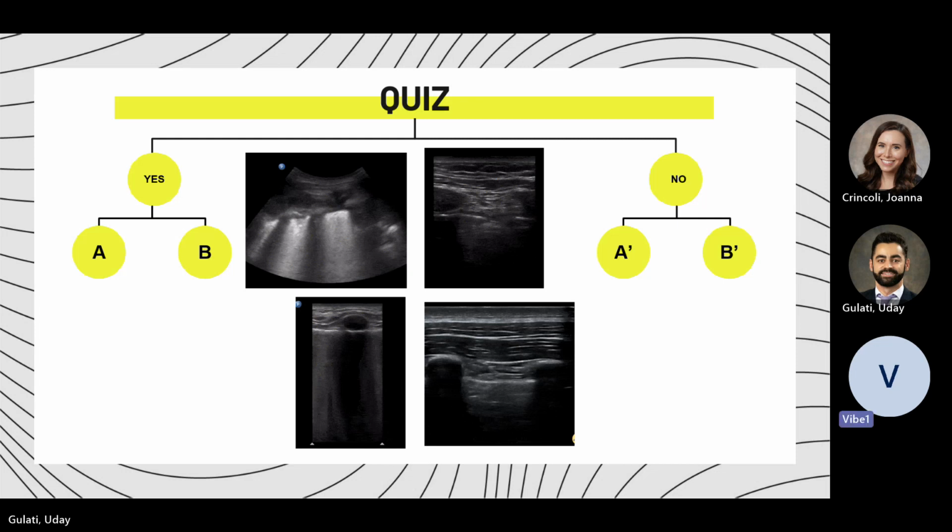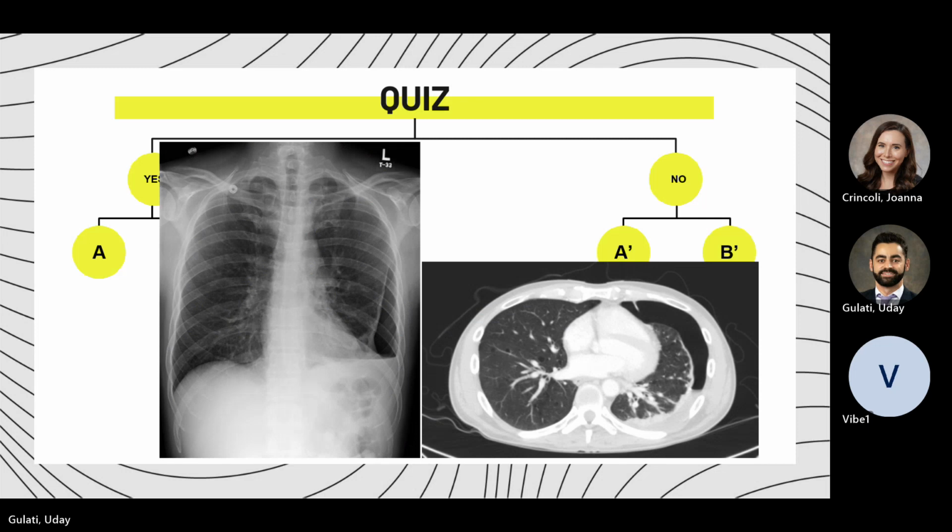Yeah, makes sense, thanks. Right, because with a pneumothorax there's air between the visceral and parietal pleura. You should not be able to see artifact or images underneath. Here you're being able to see cardiac activity, which is like reverberation going through all that atelectasis region. So looking at a real life patient, here's the heart, here's the left chest wall, here's the lung that's atelectatic. It's still going against the visceral and parietal pleura, but it's not moving. But because there's no air in this region, you're able to see the artifact of that cardiac activity, which if there was a pneumothorax, you wouldn't be able to see.